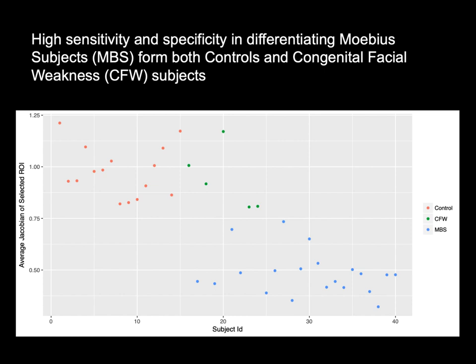In that case, we had more controls than patients, and so we could build a control template from unrelated subjects that were gender and age matched, and then essentially use that as a target for both patients and controls. And I think that is very nice, if you have the luxury of using a bunch of subjects only to build your template, an independent population, rather than building it from the subjects that you are analyzing.